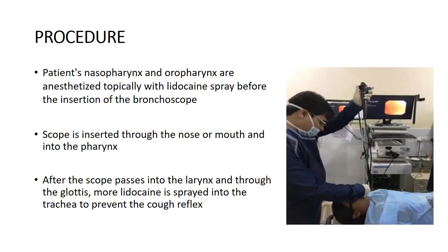Pavan. Yes, sir. It's also important that every patient should be connected to oxygen with nasal prongs. You cannot connect oxygen with a mask because you need to perform the bronchoscopy, but every patient must be connected to oxygen with nasal prongs at around 2 to 4 liters, even though the saturation is 95-98% at room air. Because once the foreign body, the scope, gets into the airway, some patients will panic and some will go into spasm. There may be secretions. So it's very important, along with the monitor, that oxygen is connected before starting the procedure.